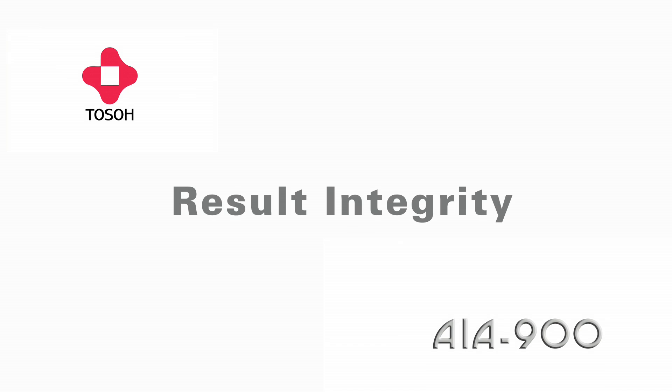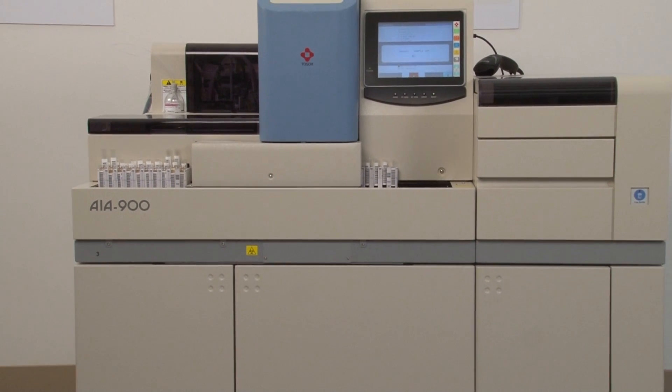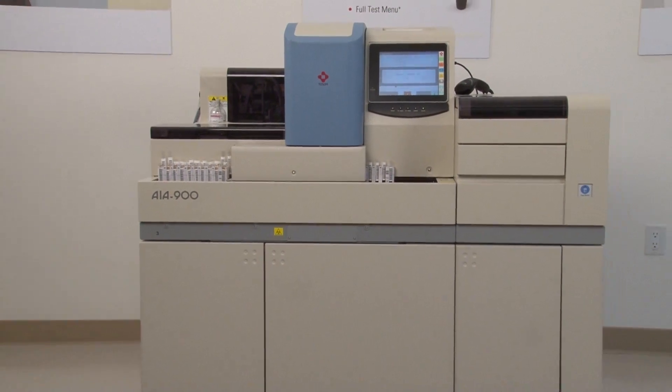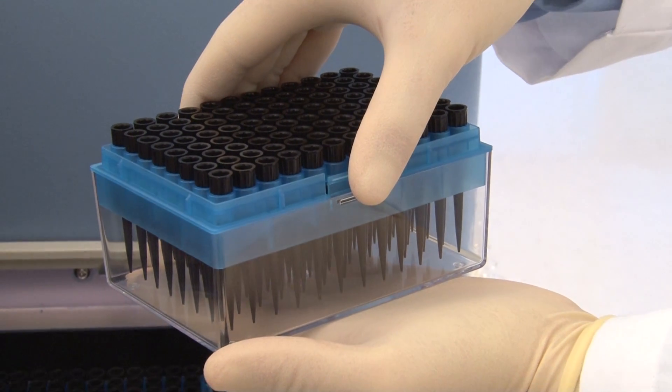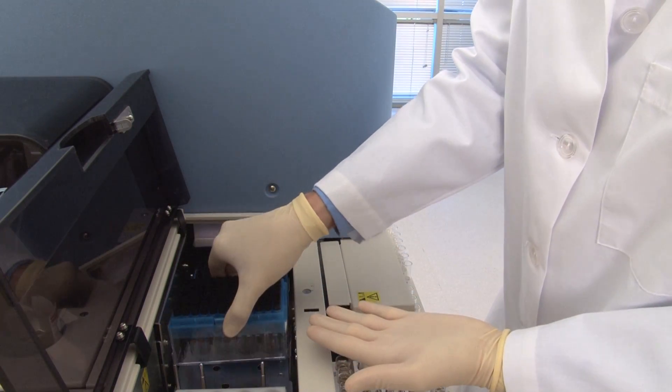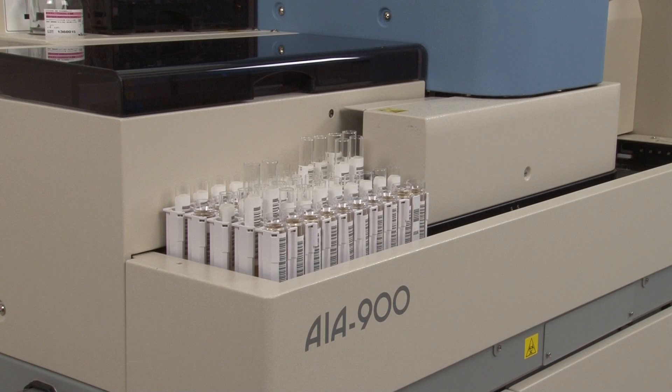Result integrity. To ensure the highest level of result integrity, the AIA 900 features several built-in safeguards including conductive disposable pipette tips for automated sample level sensing and elimination of carryover.